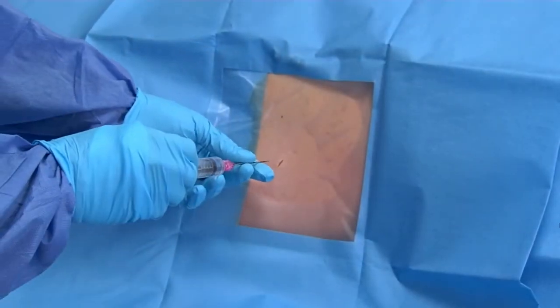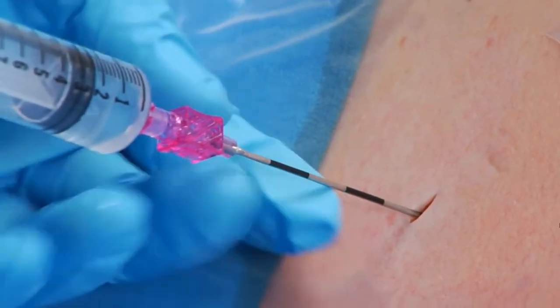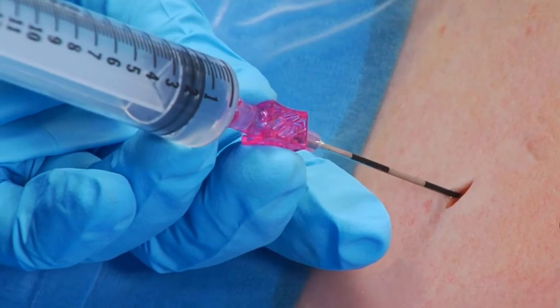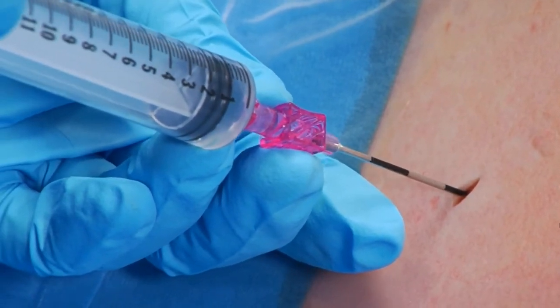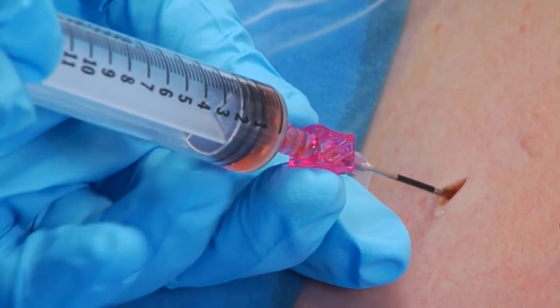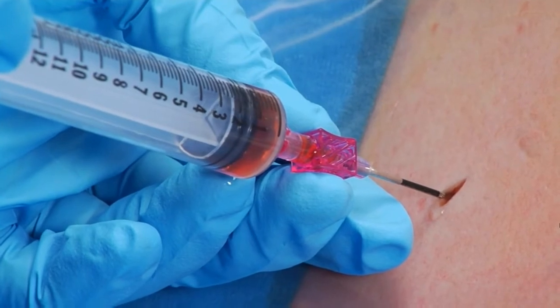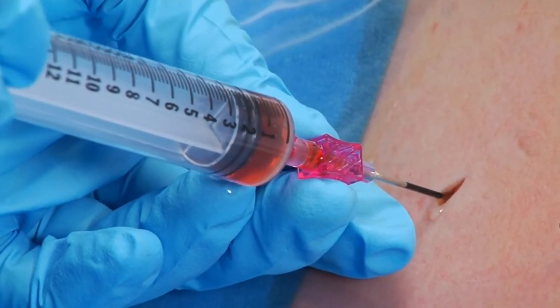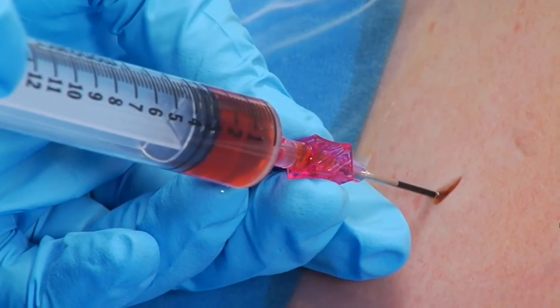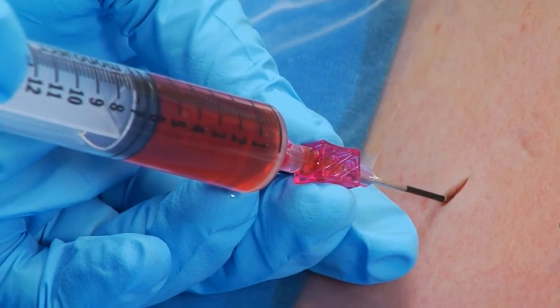Attach the introducer needle to a syringe filled with local anesthetic and administer additional local anesthetic to the skin and underlying tissues. Advance the introducer needle over the superior border of the rib and into the pleural space. Fluid or air should be aspirated to verify an interpleural position. Over-insertion of the needle and/or dilators may result in serious harm to the patient. The needle should be introduced and directed with appropriate orientation inferiorly or superiorly.